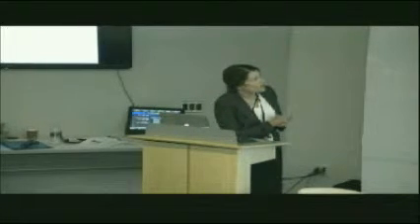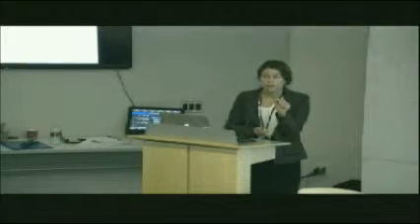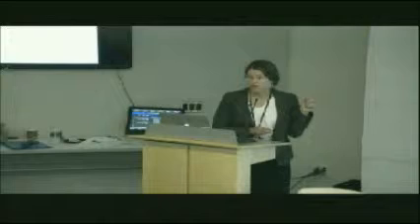So motor threshold, that's something we measure a lot. All that really means is what is the least amount of stimulation I can give a person and get a motor evoked potential. And we know that medications can actually change your motor threshold. So that's important to know because with TM there are medications that are used as well. So this could change how effective TMS is.